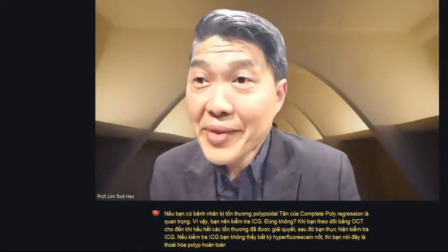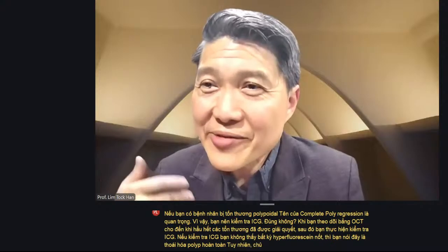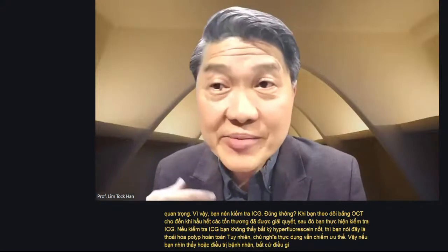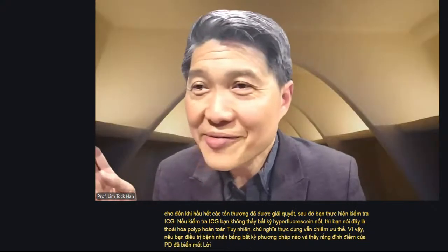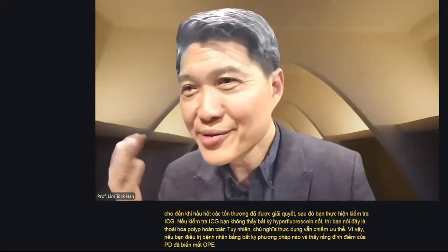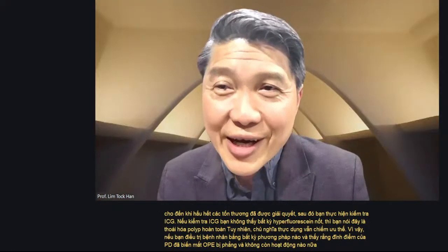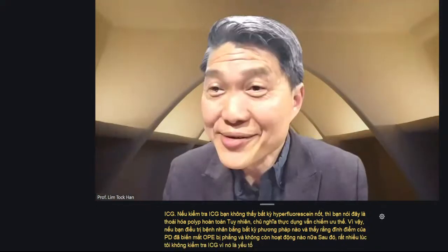Now, however, pragmatism prevails. If you treat the patient, whichever means, and you find the peak PED is gone, the RPE is sort of flattened, and there's no more activity, then a lot of the time I don't do a check ICG because most likely there's nothing there.